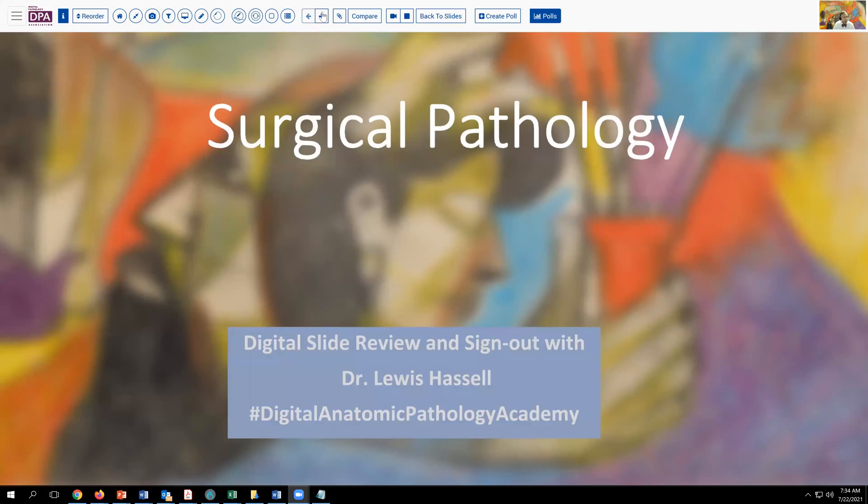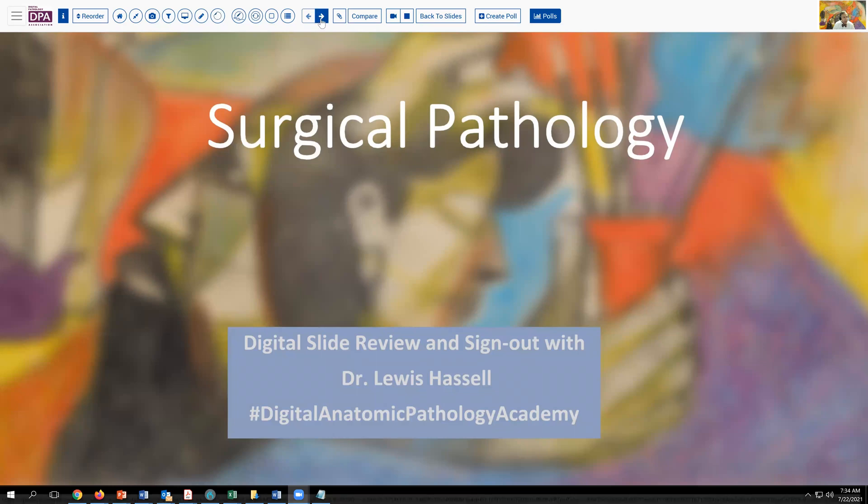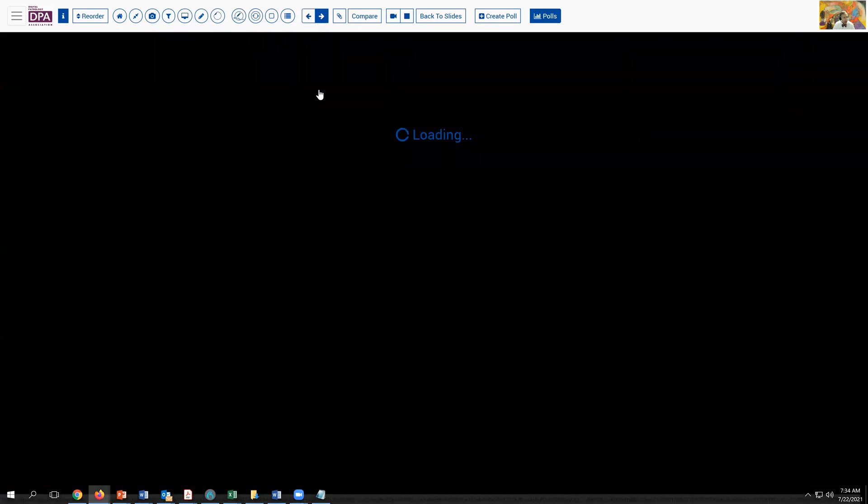Hello. Welcome to another session of digital slide review and sign out. I'm Dr. Lewis Hassell, and our program is part of the Digital Anatomic Pathology Academy, a joint venture with PATH Presenter and the Digital Pathology Association, which continues to offer complimentary memberships to members from the developing world and those in training. Our program today focuses on a topic in GI pathology.